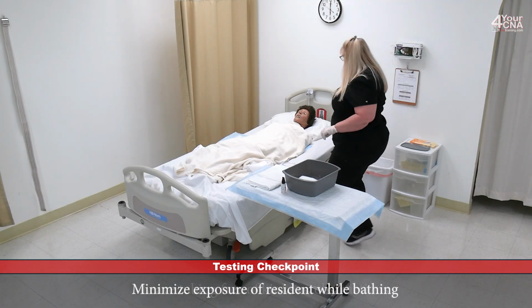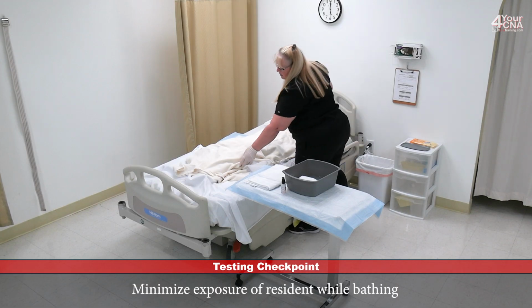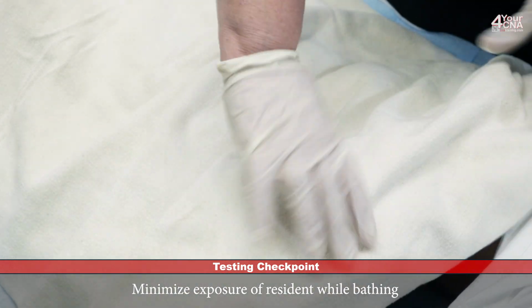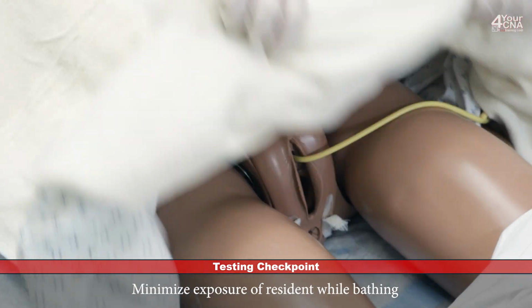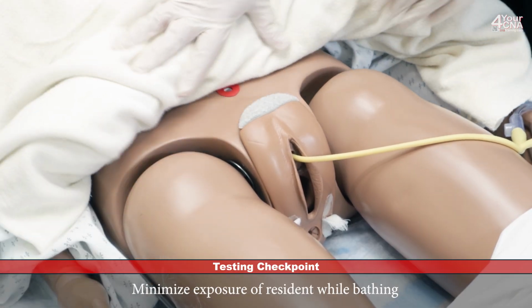Miss Jones, I'm going to expose you. I'll make this as brief as possible. But please let me know if you're uncomfortable in any way. I'm going to roll the privacy blanket, making sure that I get the gown inside the blanket as I roll it. But I don't want to grab that catheter as I'm rolling the blanket. So you want to be very gentle with this process. This is going to expose the peri area.